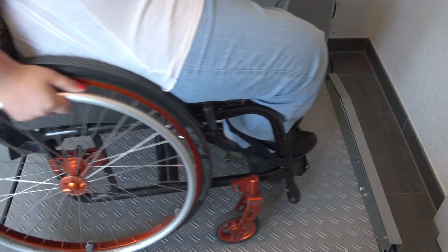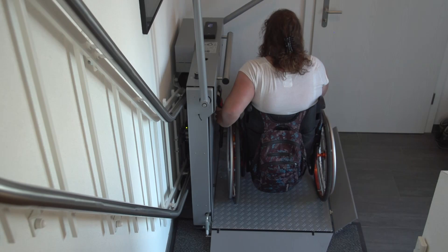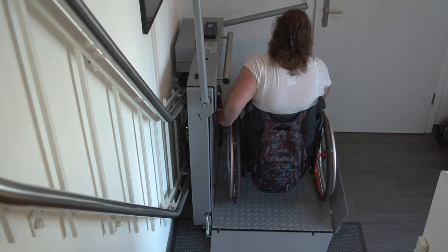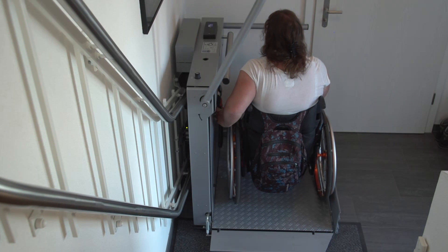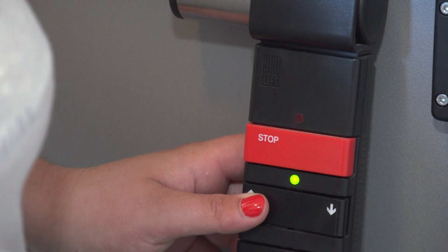Your wheelchair should be secured during travel. To ride upstairs, press the up button on the platform control and keep it pressed until the safety bars and access ramps have closed and the lift starts moving. Keep the button pressed during travel.